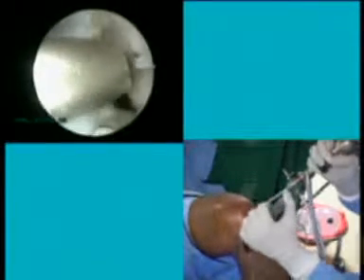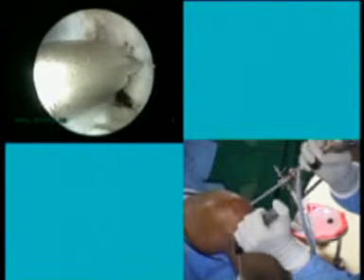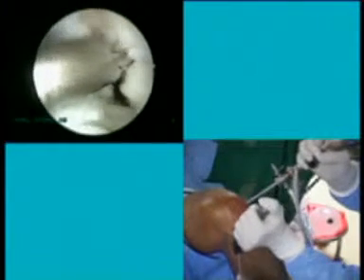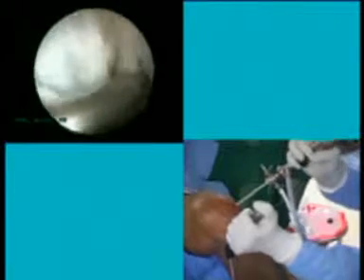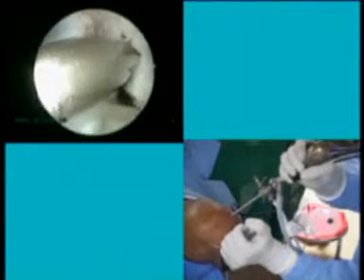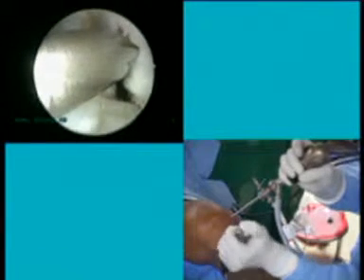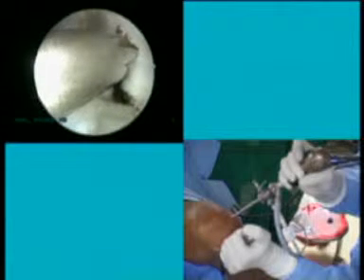Let me just put the aimer in and let's drill the K wire. So this is the K wire for the AM portal, isn't it? Yeah. And can you see how much the knee is flexed? Yes, we can. It's 110 maybe. Can you see it? Okay, then drill, please. Drill.